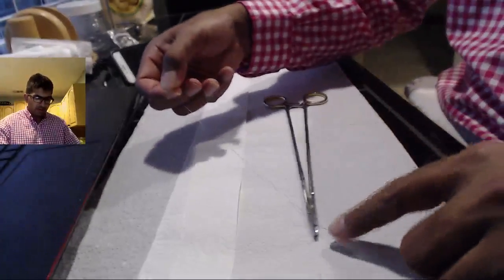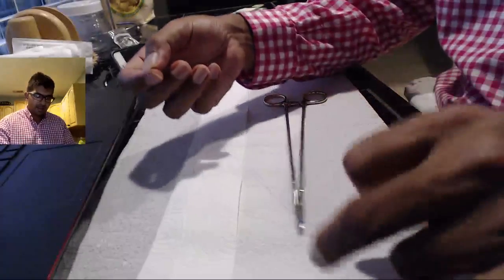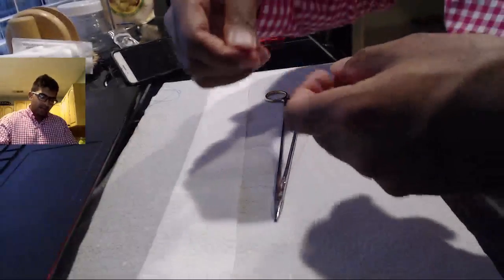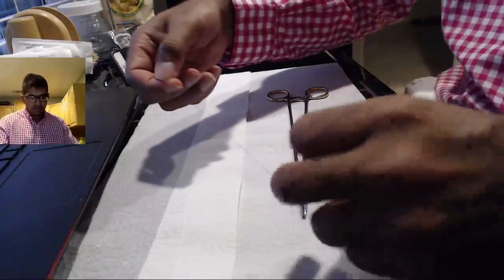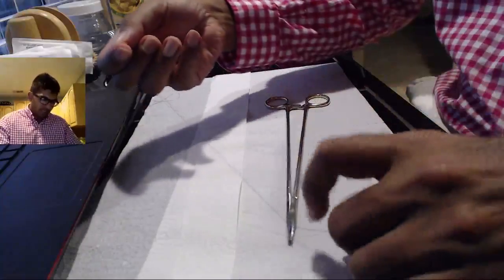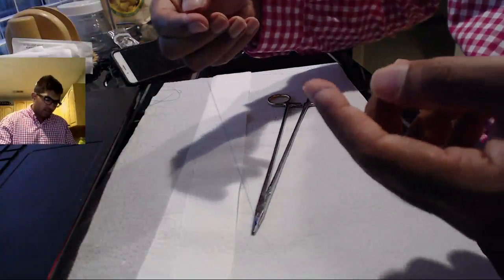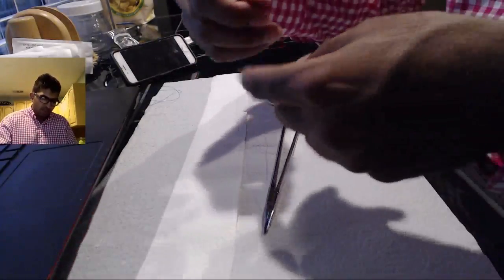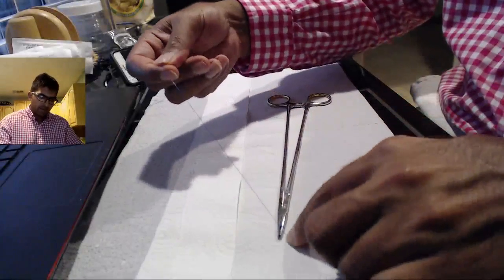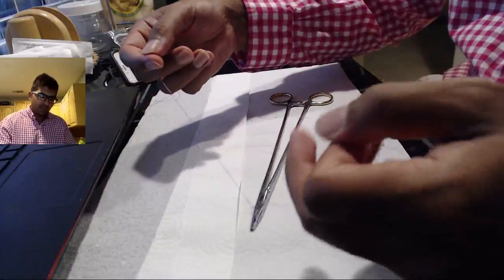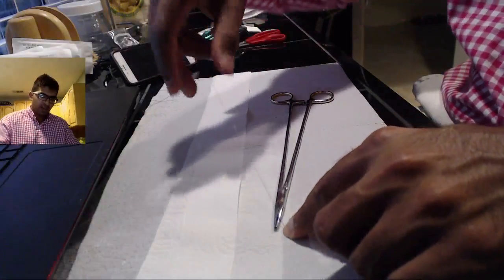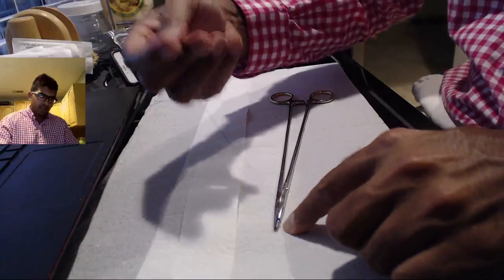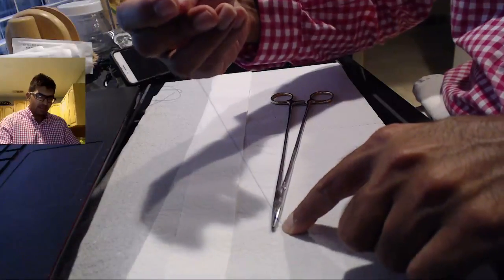Forehand, backhand. And the one nice thing about prolene is that it slides very nicely. Now, a lot of people, you'll see surgeons, cardio surgeons, vascular surgeons, wet their hands before they tie. It's not totally necessary. If you got a lot of blood on your hands and you feel like it's going to catch, then go ahead and squirt your hands. Otherwise, it's an unnecessary step. And you can just go on tying. Again, forehand, backhand. And again, you see, even if the knot looks like it's down, what I'm doing is I'm sending my fingers down and bringing my fingers below level of the knot. And this way I know. And this is the only time, like I said, I'm pulling counter tension with my right hand. Left hand's down, right hand's pulling counter tension. So the knot is down and secure.